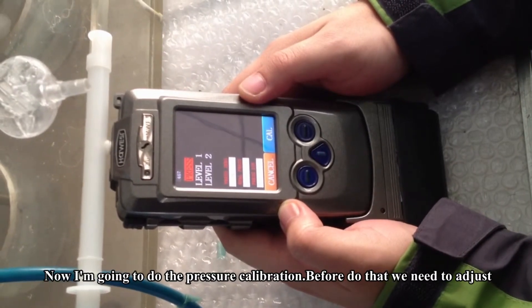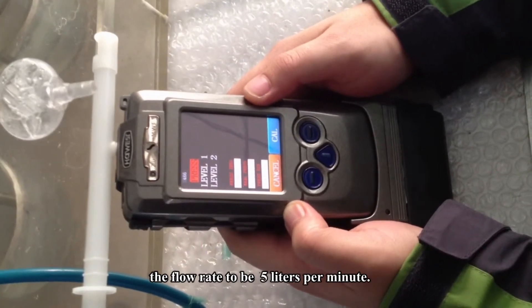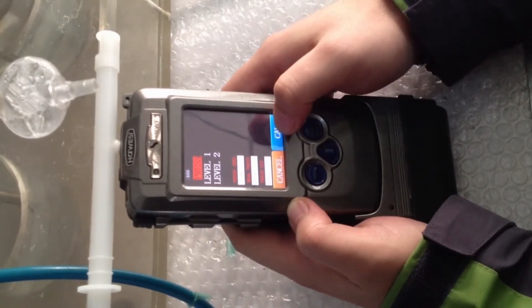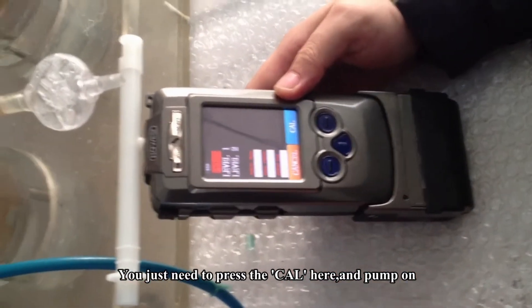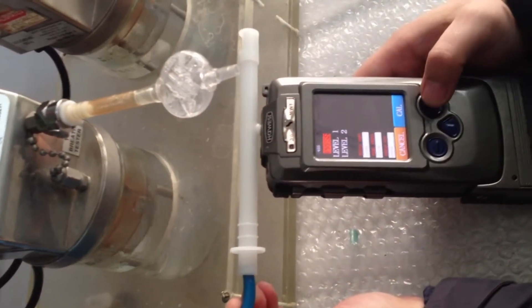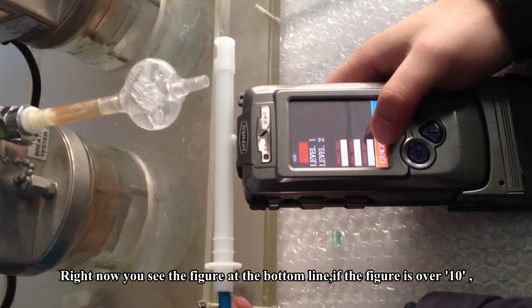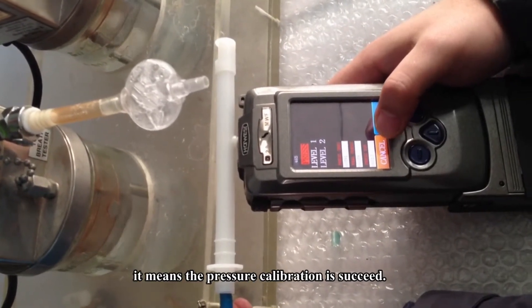Now I'm going to do the pressure calibration. Before we do that, we need to adjust the flow rate to be 5 liters per minute — I have already done that. You just need to press the calibration key here and pump on the air ring. Then press the red button here. Right now you see the figure at the bottom line. If the figure is over 10, it means the pressure calibration is successful.